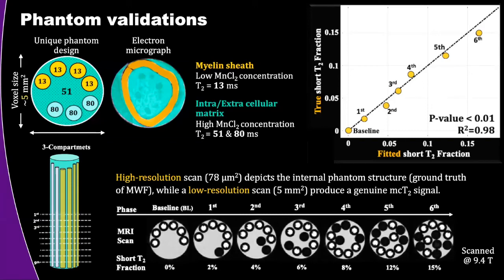So this is a very, very good question. You're barging into an open door, as they say. We're now working on phantoms that are built of filaments, like sheets, that have very small holes in them. And according to the concentration of the holes, the density and the size, they cause different levels of exchange.